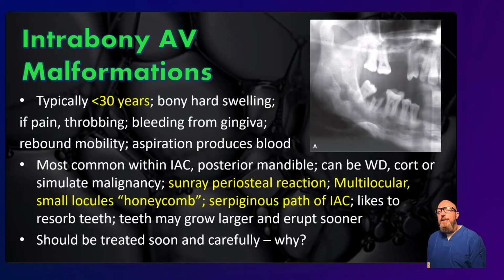All right, and this one is the high stakes slide of this whole video, so pay close attention. Intrabony arteriovenous malformations, most common under 30.